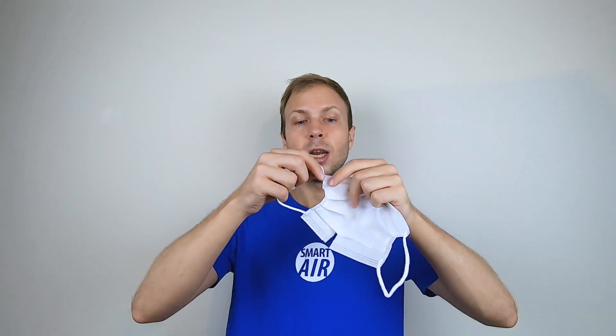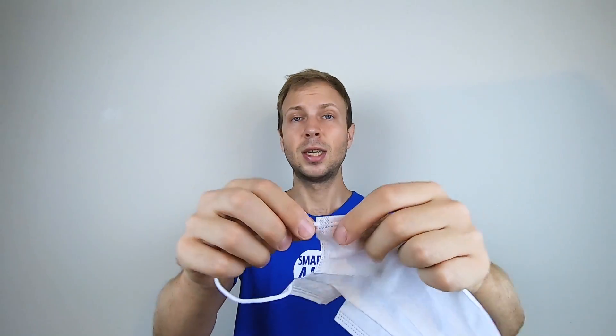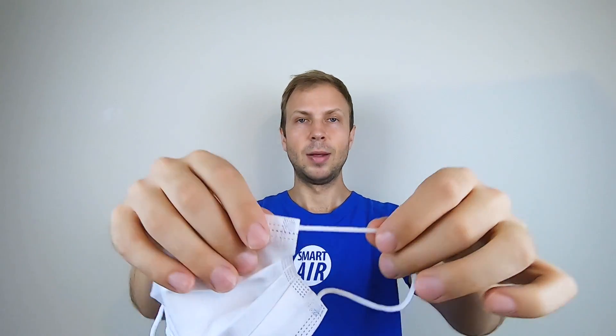If you think you'll use the direction of the straps — how they attach to the mask — to determine the right way to wear the mask, we actually found that there's no standard on any of the surgical masks, so you shouldn't use the straps to work out how to wear the mask.